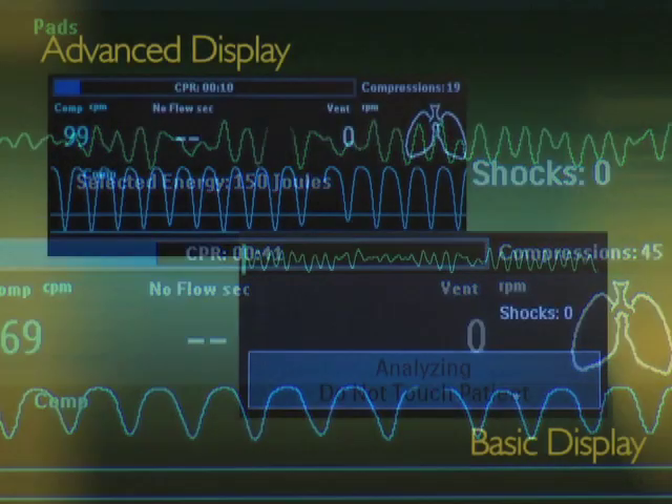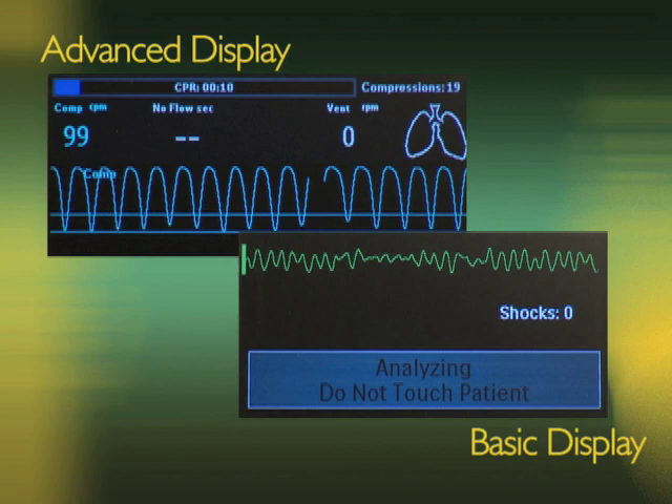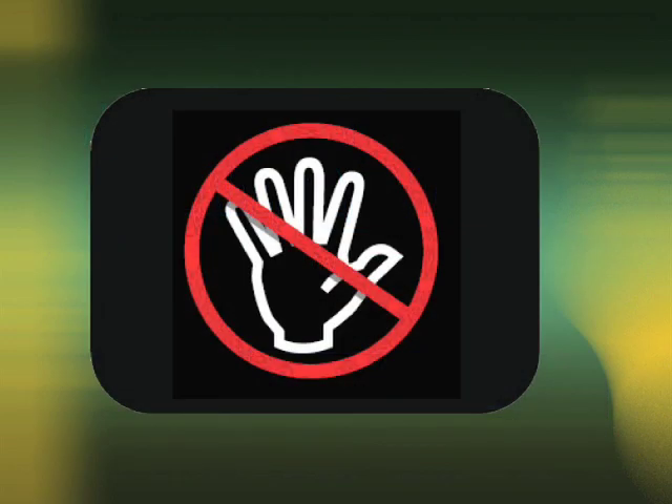In AED mode, you can choose between the same full QCPR view as in manual mode and the basic view with only text messages and voice prompts. If this icon appears when the MRX is in AED mode, stop CPR and stand clear of the patient. This indicates the MRX is analyzing the patient's heart rhythm or advising a shock.